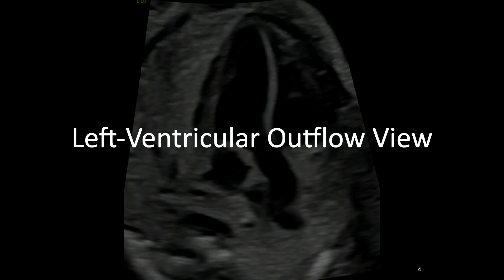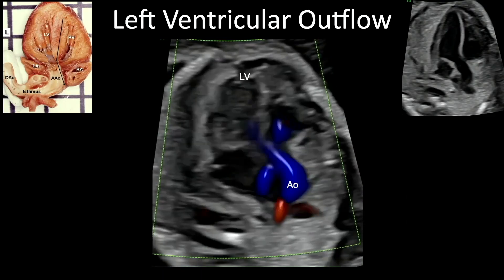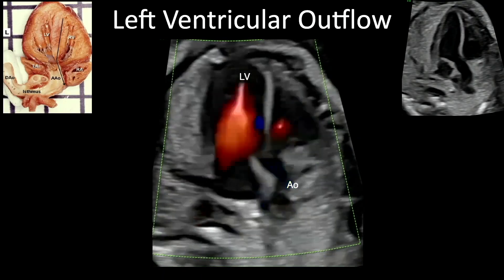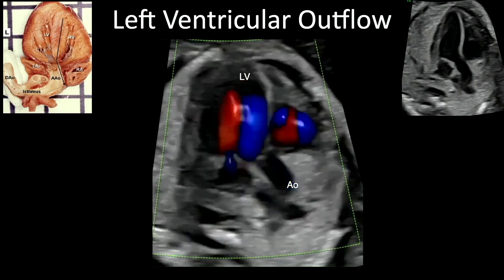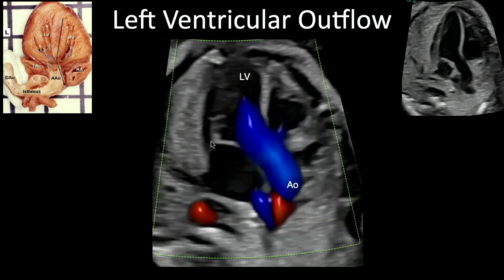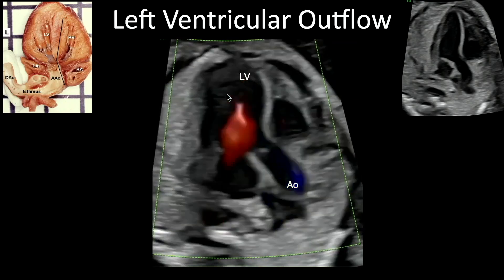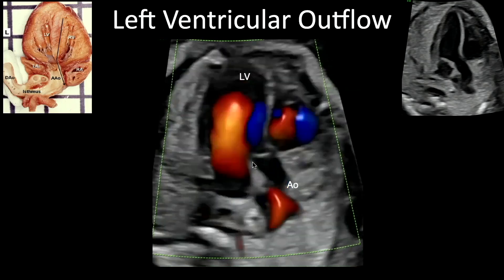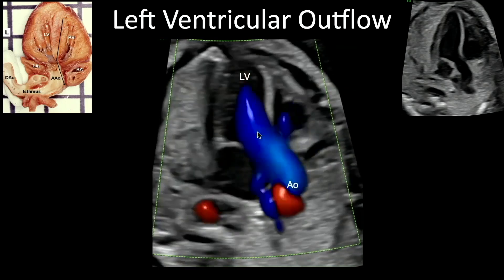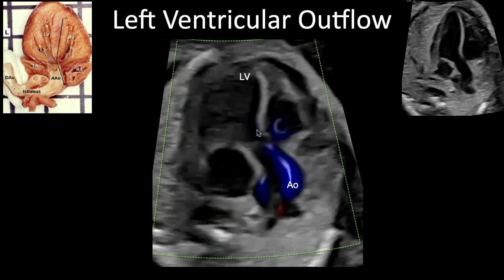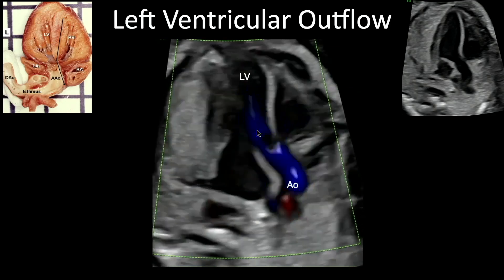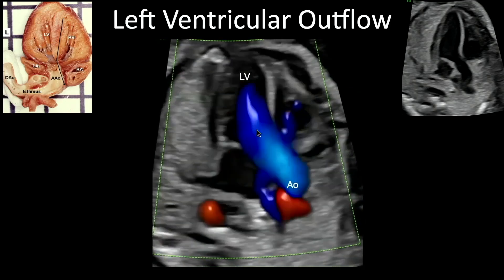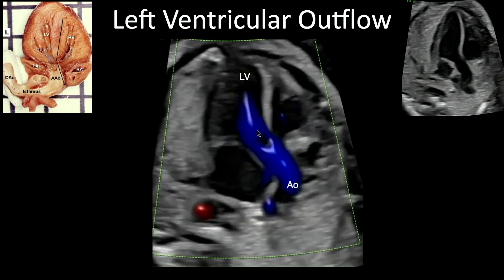Looking at the LVOT, it comes out of the left ventricle — here you see inflow into the left ventricle, mitral valve, then outflow. Both the mitral and the aortic valve are in the same plane, unlike on the right side, where the tricuspid inflow and the pulmonary outflow are not in the same plane and are actually in a different orientation.